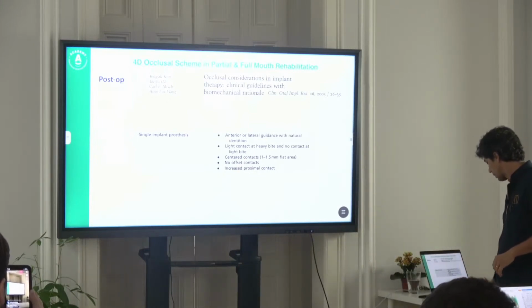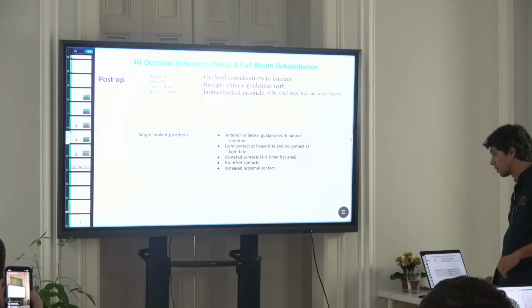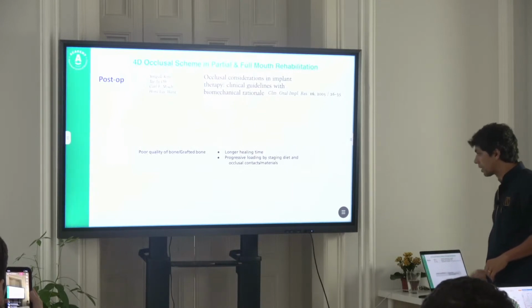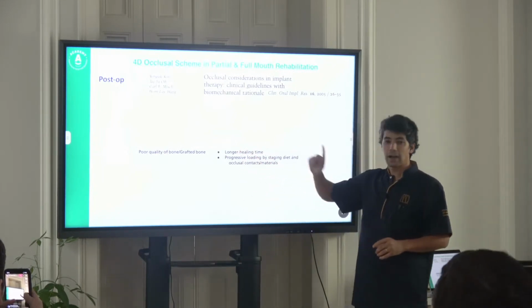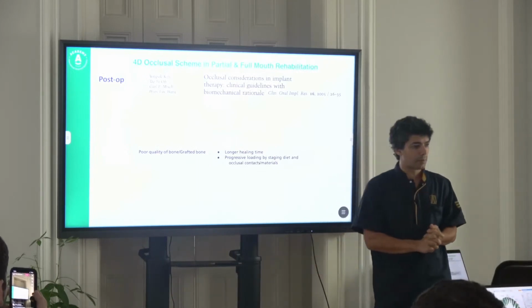So we are finishing, and just finishing with the poor quality of bone or grafted bone. Now we use the ISQ levels to assess if it's time to rehabilitate.